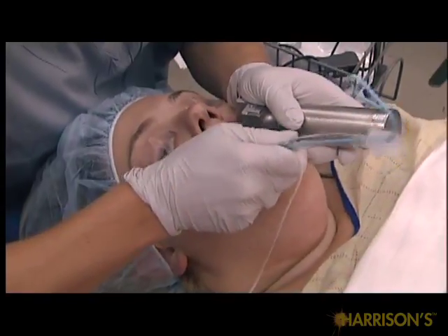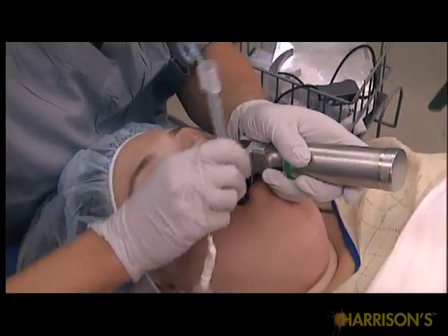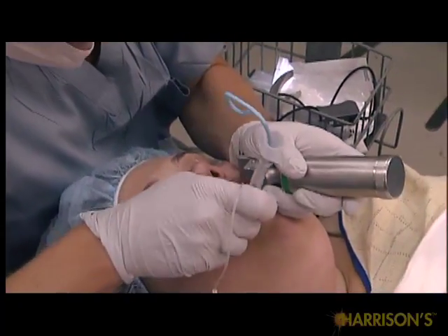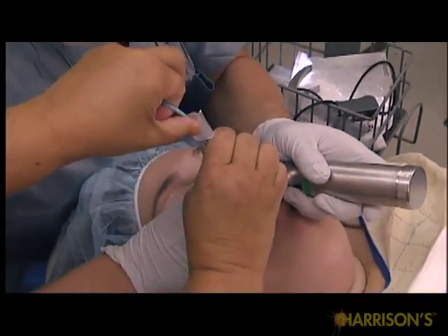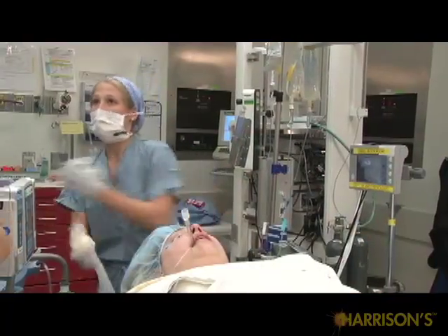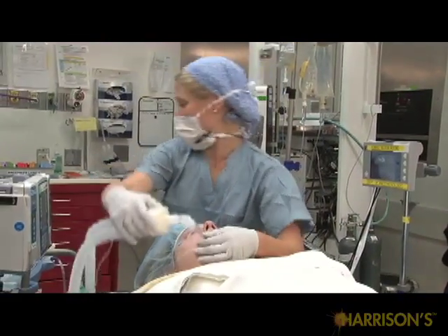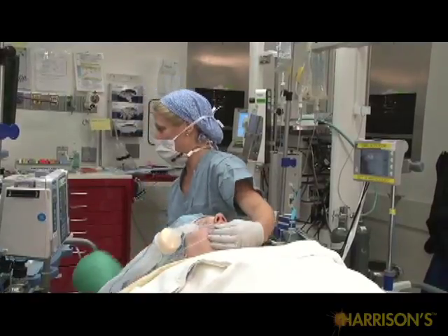Once the vocal cords are visualized, the styleted endotracheal tube is passed through the vocal cords. It is important to remove the stylet once the tube is through the cords. If the rigid stylet is advanced too far, it can cause injury to the trachea. Once the stylet is removed, the endotracheal tube cuff is inflated with the minimal amount of air needed to prevent a leak when using positive pressure ventilation.